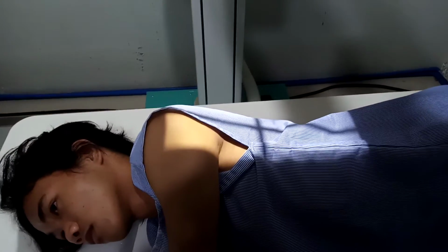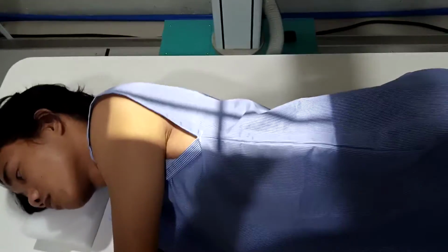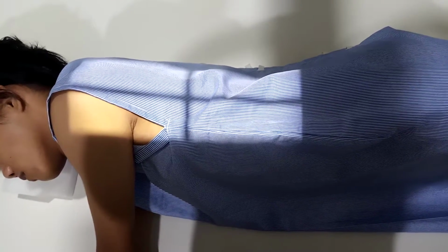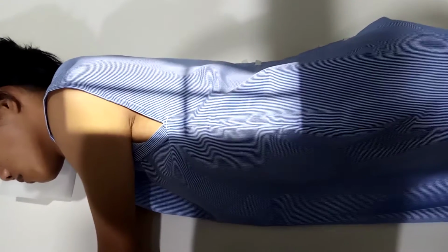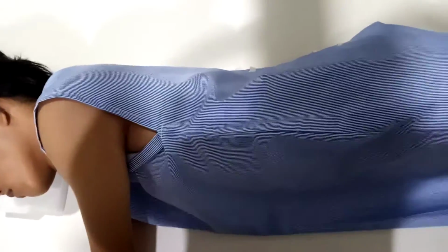Then collimate. Adjust the collimation to 7 by 17 inches or 18 by 43 centimeters. Then place side of the marker in the collimated exposure field.